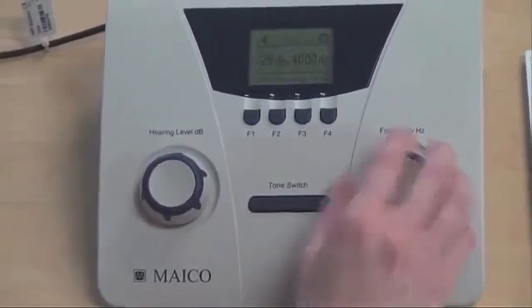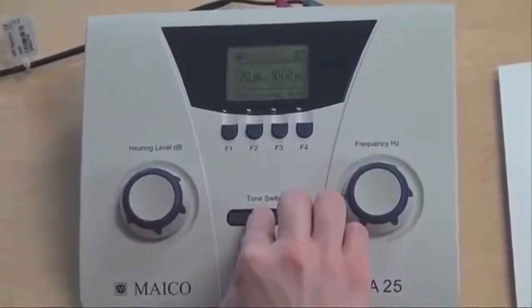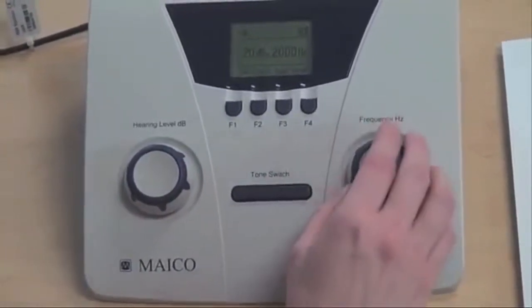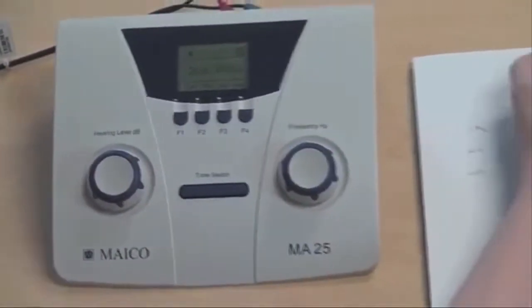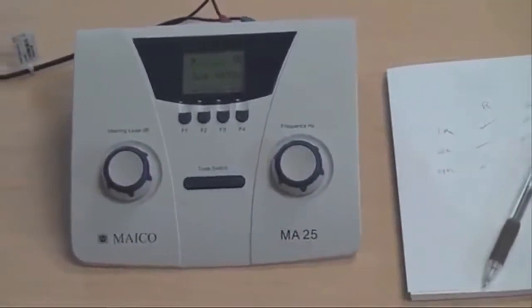Keep the level dial at 20 dB and repeat the same procedure for all three of the test frequencies, including 1000, 2000, and 4000 Hz. The child needs to respond to all test frequencies in each ear in order to pass the screen. If the child does not respond to even one of the frequencies, they do not pass the screening and are referred on for further testing.